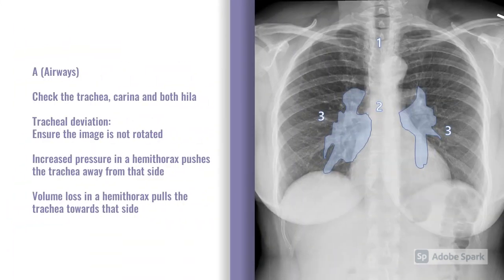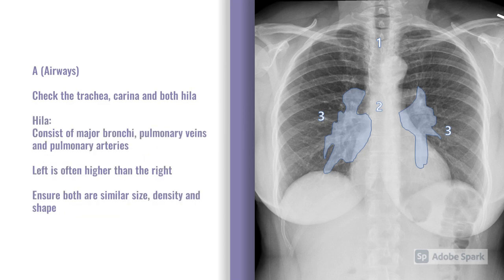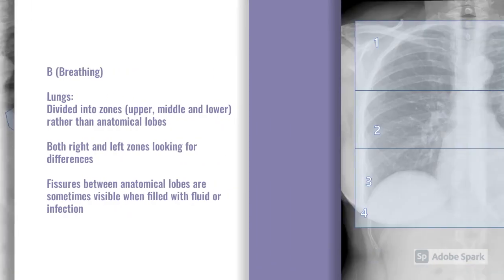When we're looking at A — airways — we're particularly interested in the trachea and the hila. Number one is the trachea, number two is the carina, and three are the hila bilaterally. We want to check for tracheal deviation. If you do have a deviated trachea, it's helpful to work out if it's been pushed or pulled. If pushed, there's increased pressure in one hemithorax pushing the trachea away. If pulled, there's volume loss pulling the trachea towards that side. The hila should ideally be a similar size, shape, and density — they're essentially a combination of the bronchi, pulmonary veins, and pulmonary arteries.